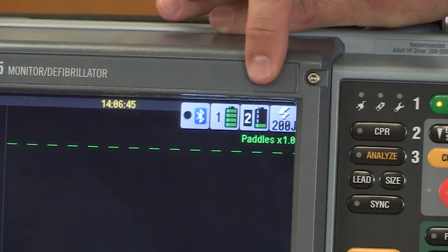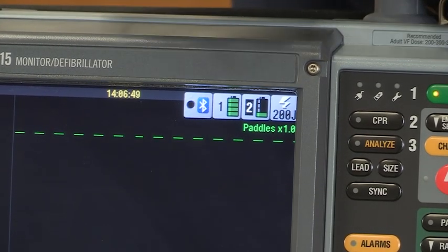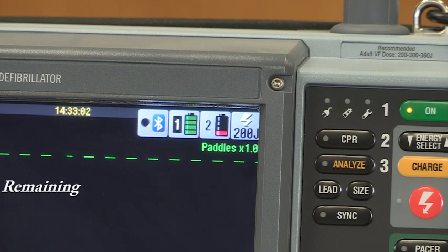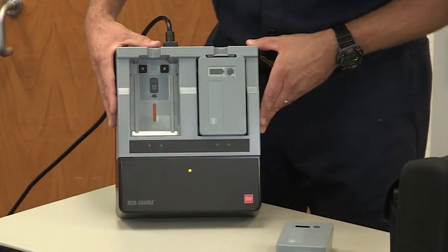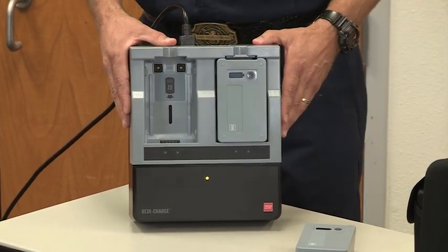As the charge goes down on that battery, you'll see that there's only one green bar on battery 2. It'll go to a yellow bar, which lets us know that it has 5 to 10% life remaining. Once it goes to a red bar, that's less than 5% remaining, at which time it'll automatically switch over to the full battery in battery bank 1. Now we'll take a look at the desktop charging unit that comes with the LIFEPAK 15.